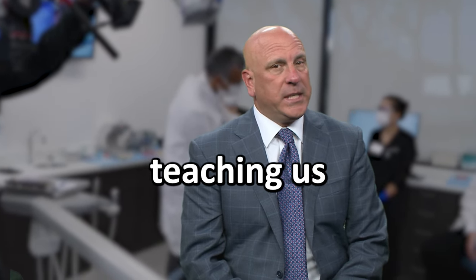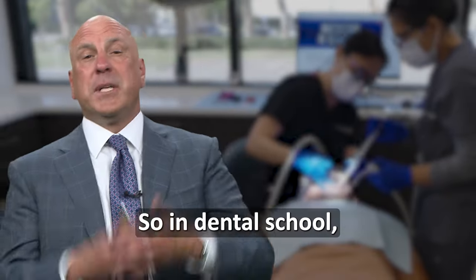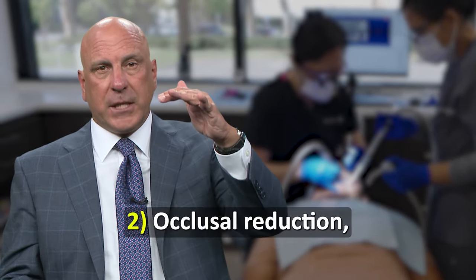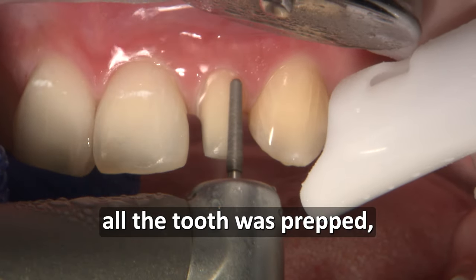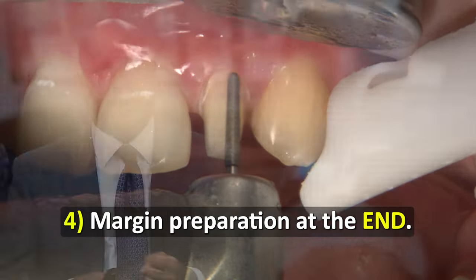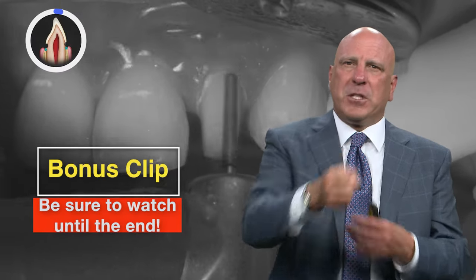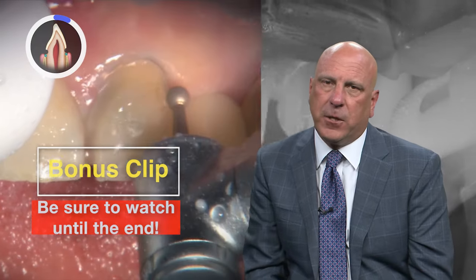I believe that dental schools are teaching us the wrong way to prep teeth for crowns. In dental school I was taught to break the contacts, then do occlusal reduction, axial reduction, and once all the tooth was prepped, go do the margin at the end. I found that to be very difficult, and prepping the gingival margin last is the most difficult way to prep a good margin on the tooth.